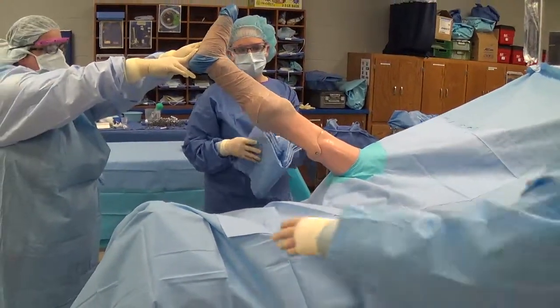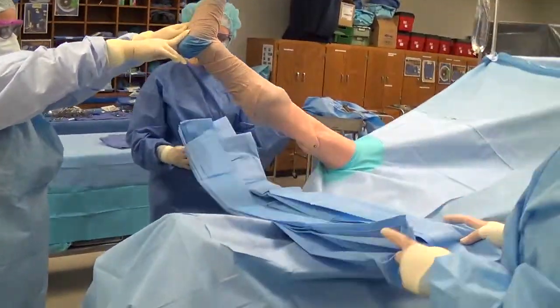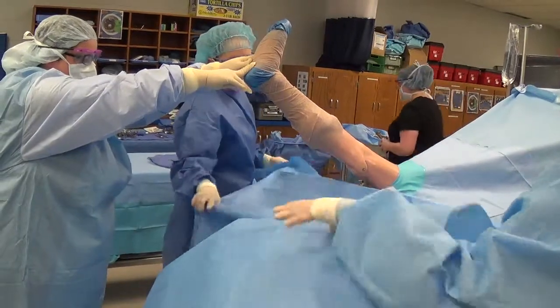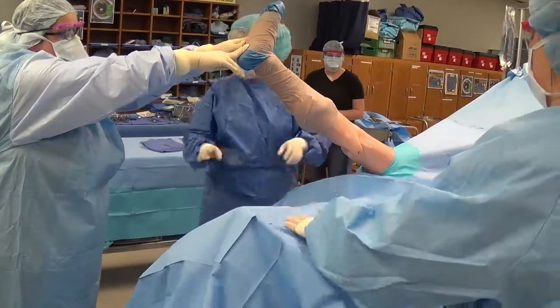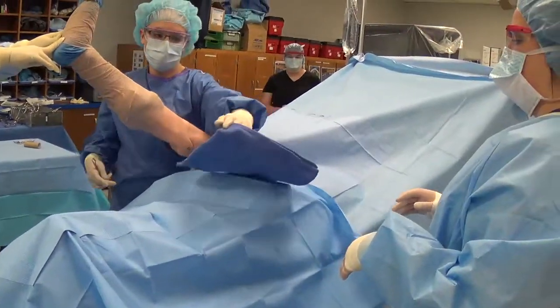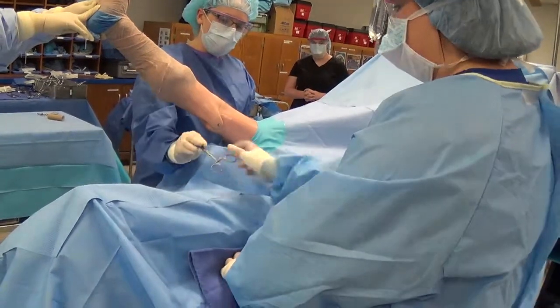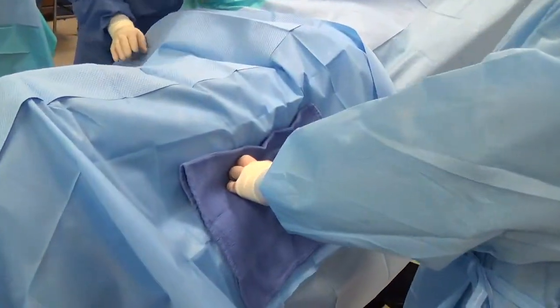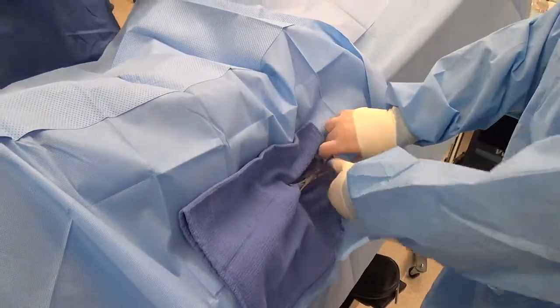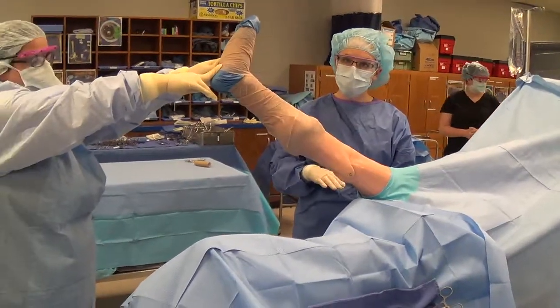In orthopedics we tend to use a lot of heavy instruments with sharp edges, so a lot of times we will add an extra layer of reinforcement by adding a three-quarters sheet — just open it up, cup your hand, and extend it out over the foot of the bed. Because we tend to move the leg through a range of motion during the case, on the non-operative side of the field we will place a towel and a non-perforating towel clip and clamp the drapes to the mattress on the OR bed, which helps prevent the drapes from shifting from an unsterile level to a sterile level.